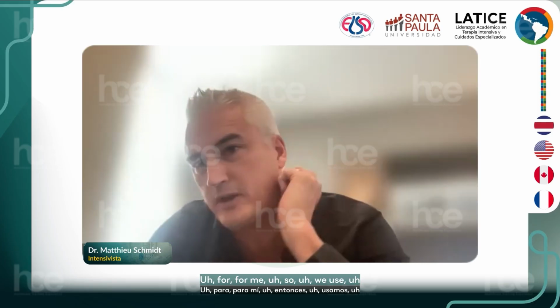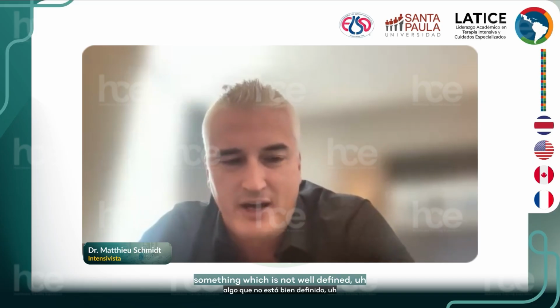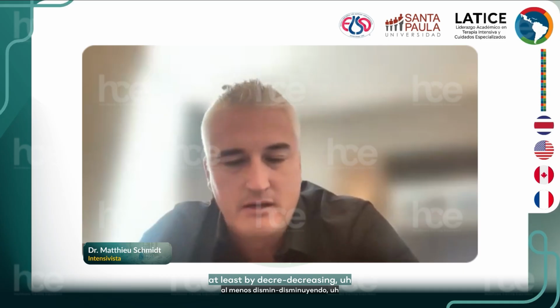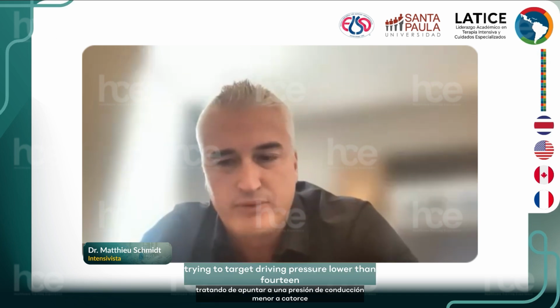Great. I think Matthew already almost told me this, but how do you ventilate your patients once you put them on ECMO? For me, we use something which is not well defined, but it's a global entity, called ultra lung protective ventilation. So the idea is really to rest the lungs, by decreasing most of the respiratory settings: the respiratory rate, the tidal volume, and the driving pressure, trying to target a driving pressure lower than 14.